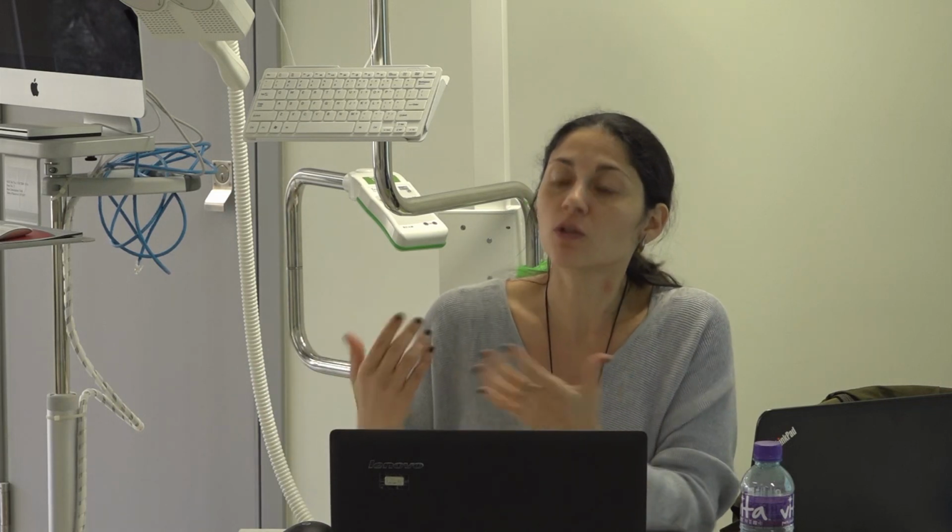For patients, it is different. I think I have some slides here. Depending on the type of study, in the safety guidelines you have three types of study. One is for patients, type 1, when the benefit is higher than the risk. So if you are applying a therapy, and the benefit that the person, child or adult, can receive from this treatment is superior to the risk, so you apply it.